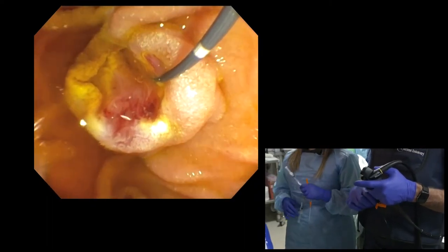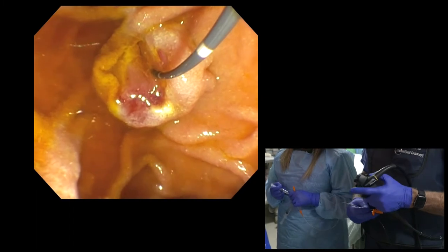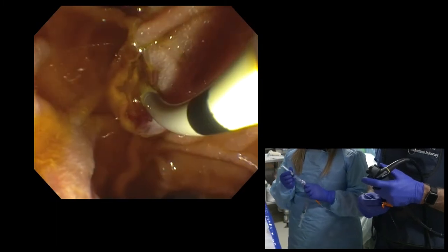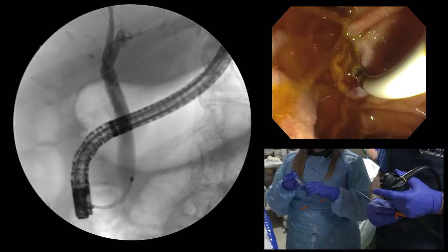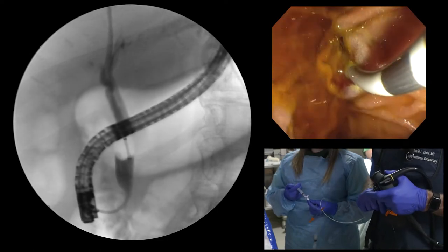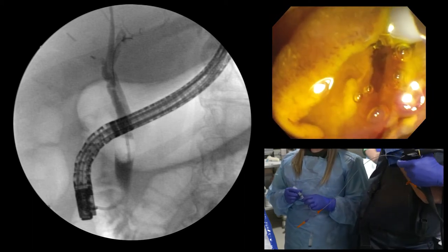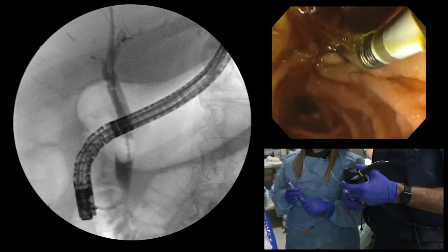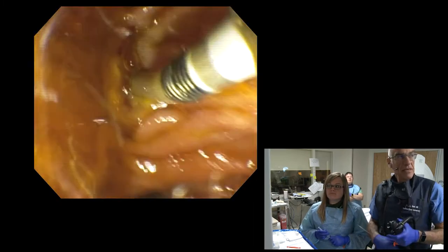Here we'll match the balloon size to the duct size, and that duct is bigger than 12mm, so I suspect a 15mm balloon is the right size to use here. We have a multi-sized balloon, the Cook balloon. Inflate. 15mm is exactly the right size. That duct — no stones. I wasn't expecting any. The 15mm balloon comes out; the duct is empty.